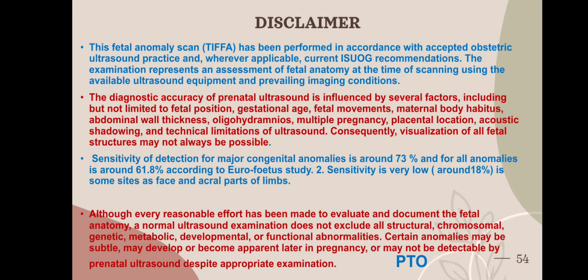Every TIFFA report should include an appropriate disclaimer. The presentation emphasizes that the examination represents assessment of fetal anatomy at the time of scanning according to accepted obstetric ultrasound practice and current ISUOG recommendations where applicable.